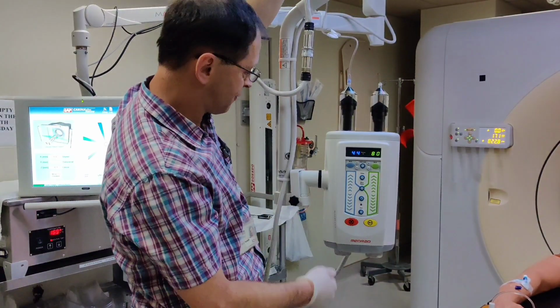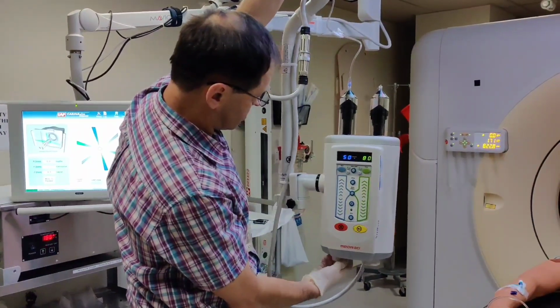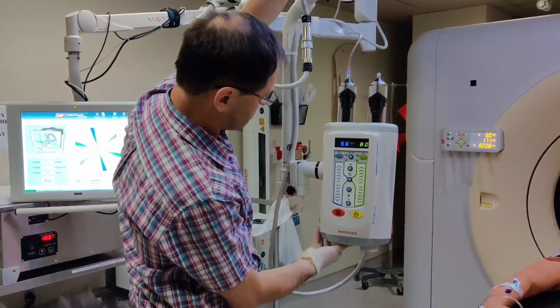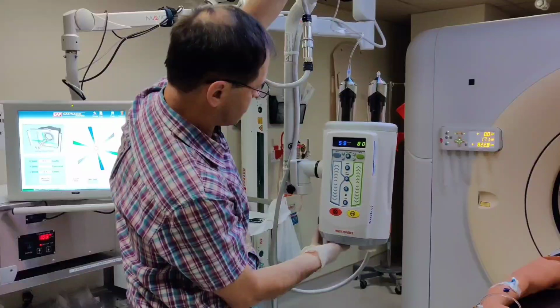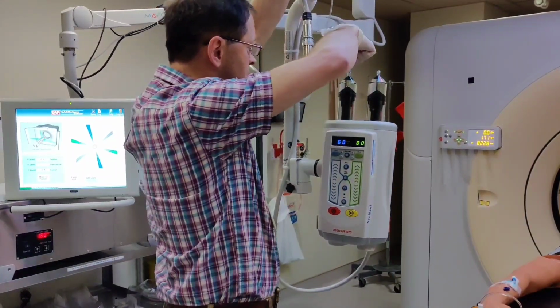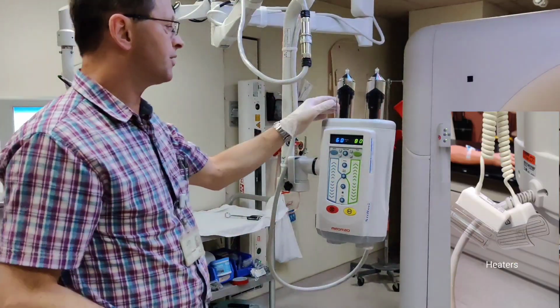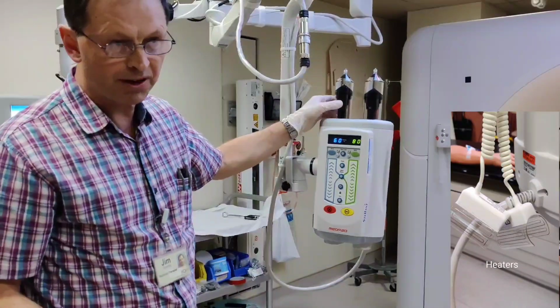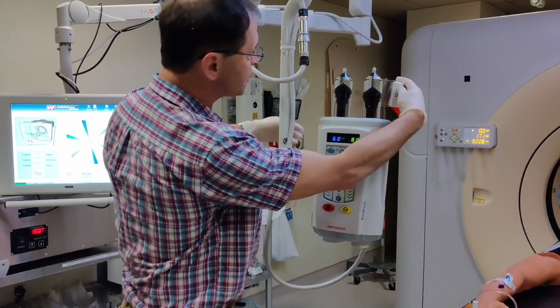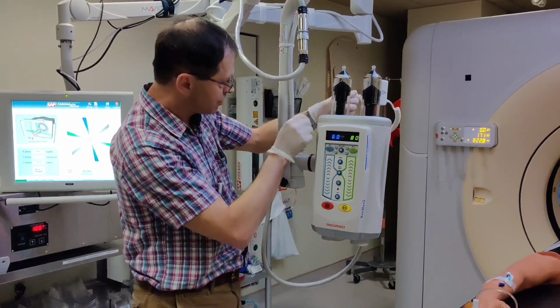So the system stopped at 44. I'm going to draw quite a bit more in. Maybe I'll go to 60. And then I can disconnect. There we be. At this point, now that you've got solution in here, we need to keep it at the proper temperature. So we do have heaters on the back here that should go around each of the syringes, and that will keep the contrast and saline at the appropriate temperature.